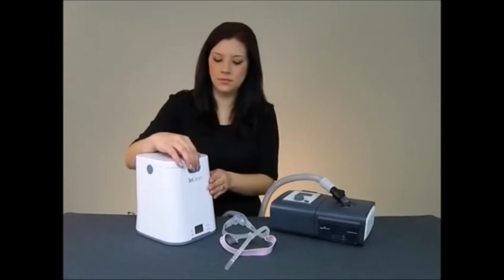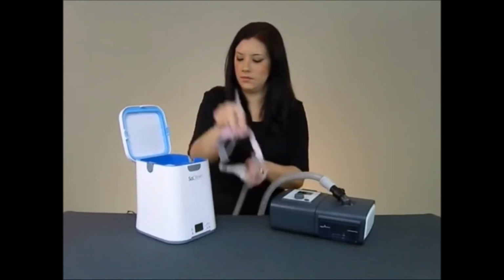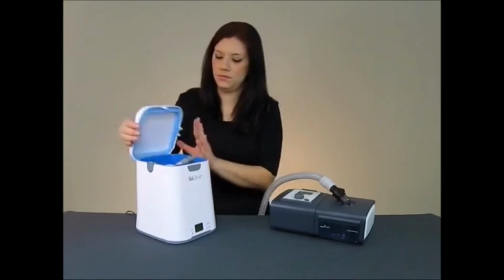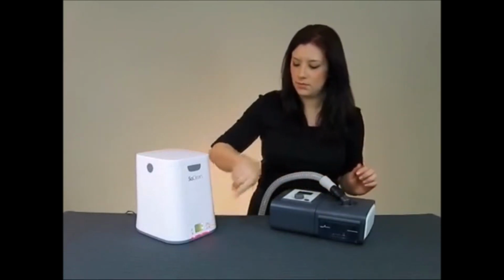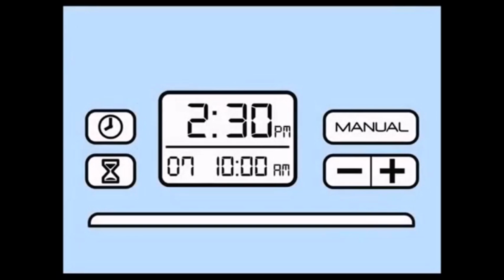For those times when you wish to sanitize your equipment apart from your scheduled cycle, simply place your mask inside the SoClean like you normally would and push the manual button. The SoClean will then operate according to your preset runtime. Your stored timer settings will not be affected. As you would during normal operation, wait for the green light before removing your equipment.